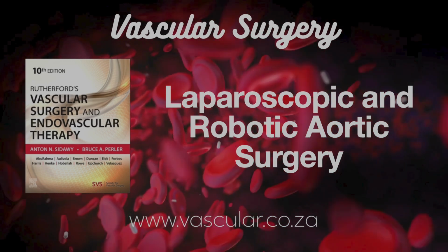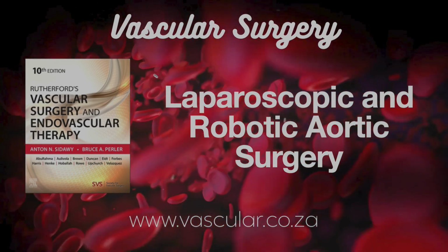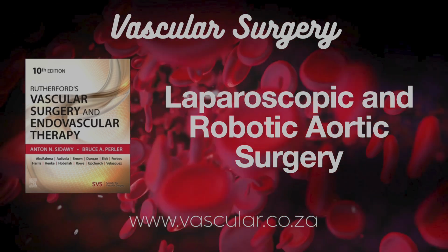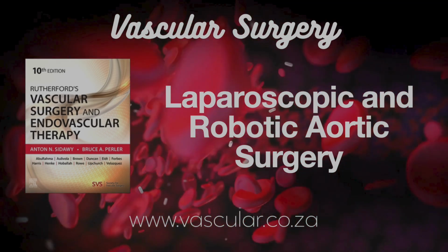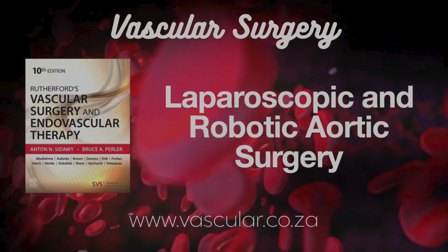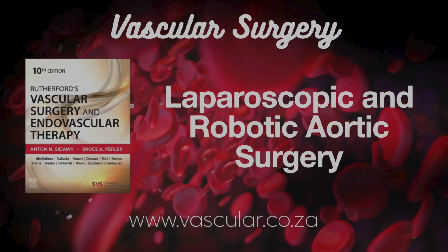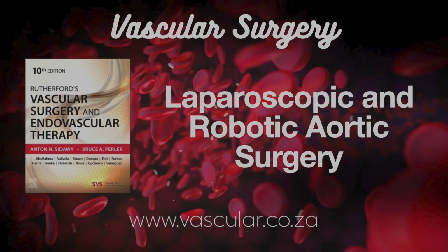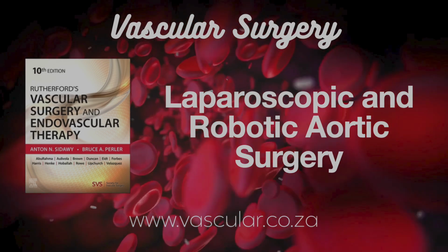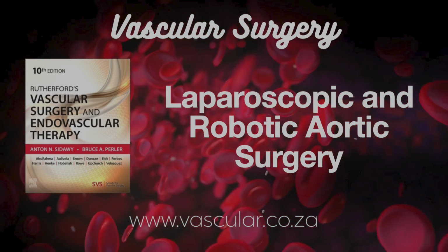The femoral arteries. Right. So the graft, often Y-shaped, gets carefully tunneled down towards the groin using another laparoscopic instrument, maybe a clamp. Okay. And there's an interesting detail for that first approach, the retrocolic prerenal one. Yeah. Sometimes the tied-off end of the graft's left leg is just left inside the abdomen after it's sewn to the aorta.